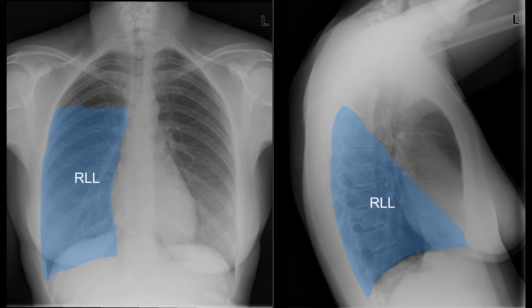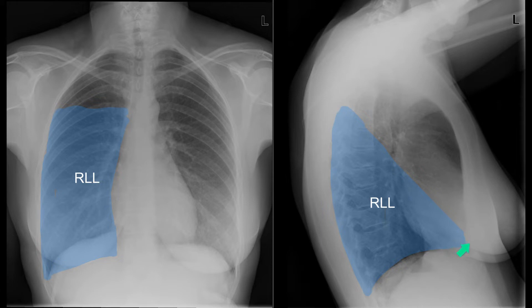On the PA radiograph, the right lower lobe occupies a significant area on the two-dimensional film. The lateral film sometimes shows the oblique fissure, which runs from about T4 to the anterior corner of the chest. In a right lower lobe collapse, the collapse occurs towards the mediastinum and towards the posterior chest wall.